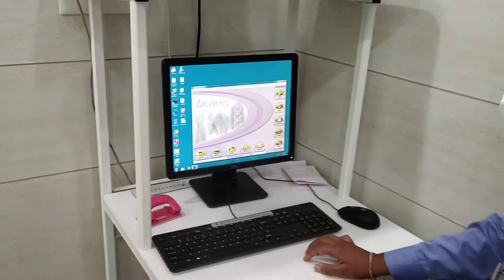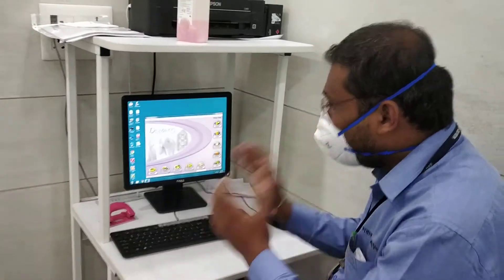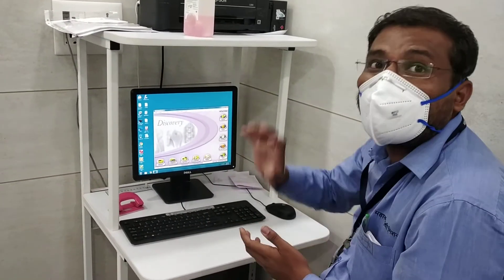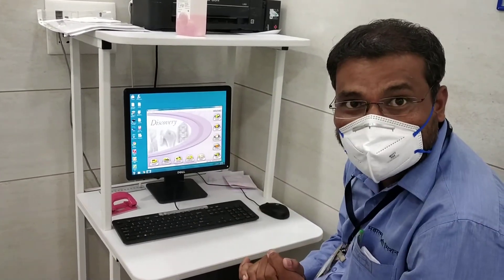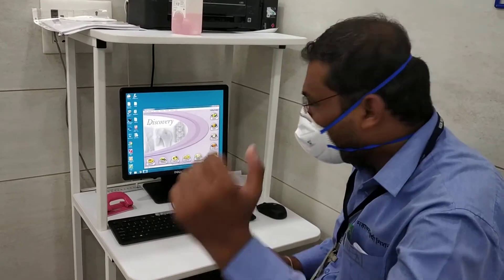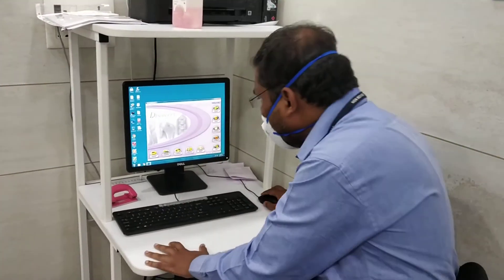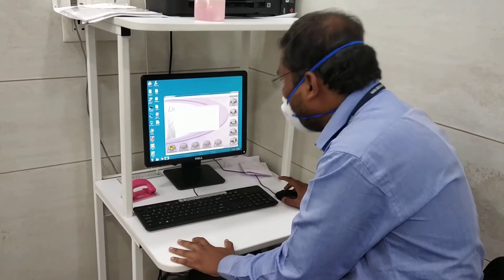One thing which is recommended by the company — on a daily basis you have to perform a quality check of the machine. For that, what you have to do is press on the Daily QC.